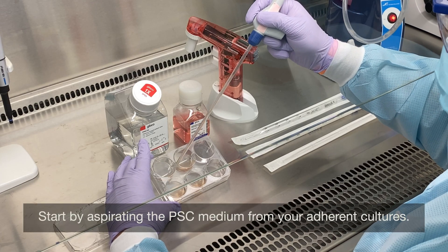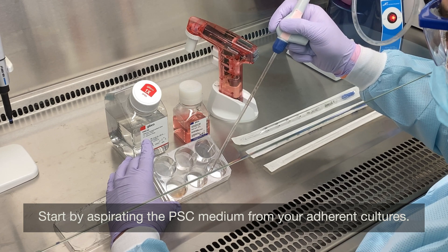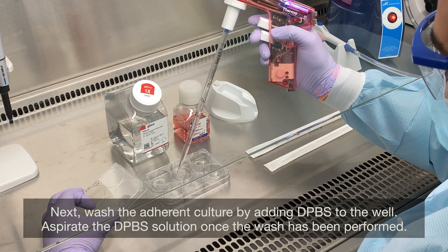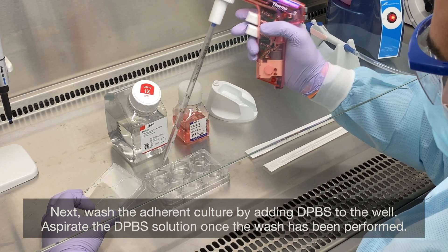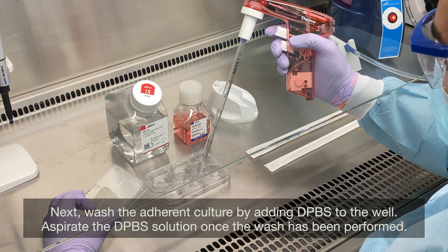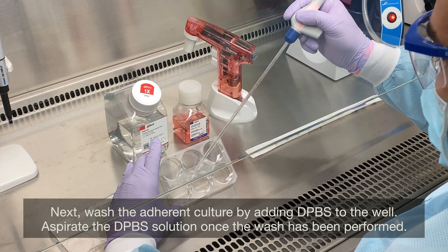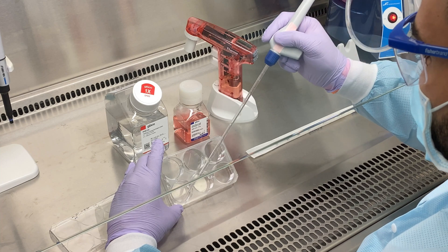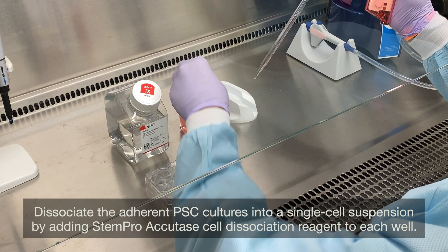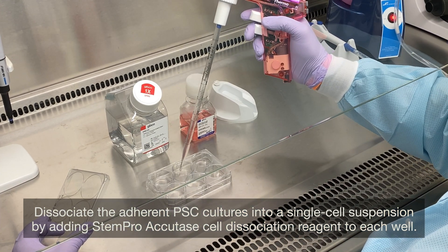Start by aspirating the PSC Medium from your adherent cultures. Next, wash the adherent culture by adding DPBS to the well, then aspirate the DPBS solution once the wash has been performed. Dissociate the adherent PSC cultures into a single cell suspension by adding StemPro Accutase Cell Dissociation Reagent to each well.